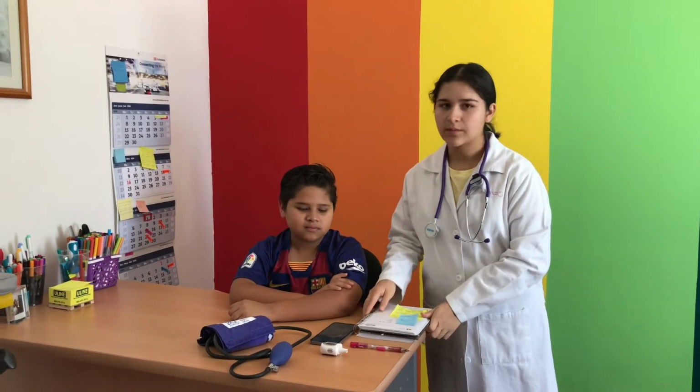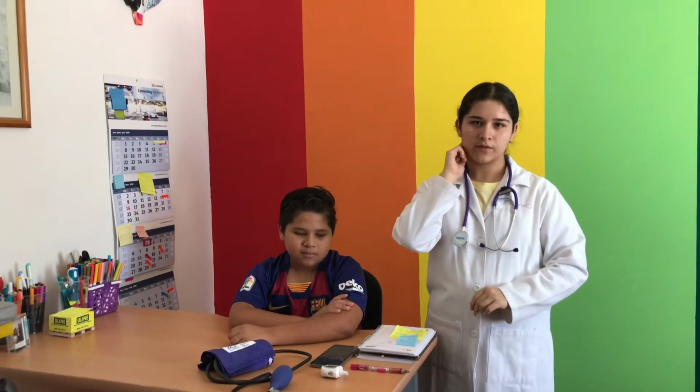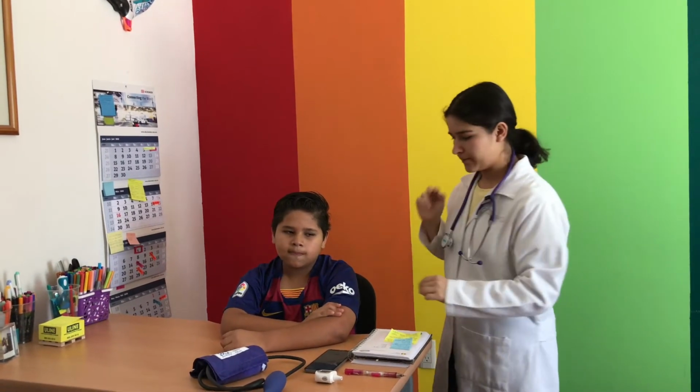So the second test we're gonna run is his pulse rate. That's the number of times his heart beats per minute. This can vary because of your exercise, of an illness, if you have a heart condition, or even because of your emotions. To do this, I'm gonna measure it here in the wrist, the radial, in the arm, which is the brachial, or in the neck, which is the carotid. If that doesn't work, I'll be using the stethoscope.